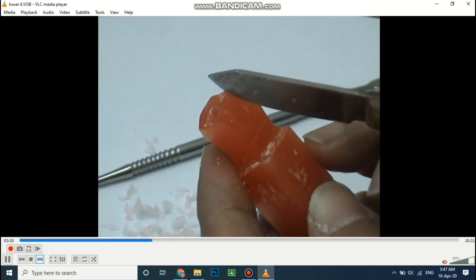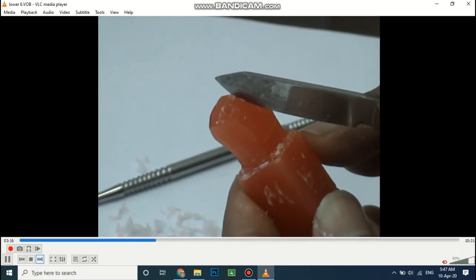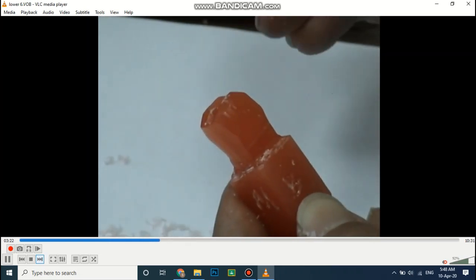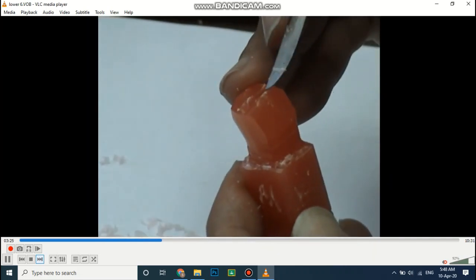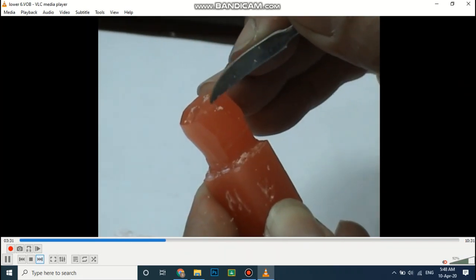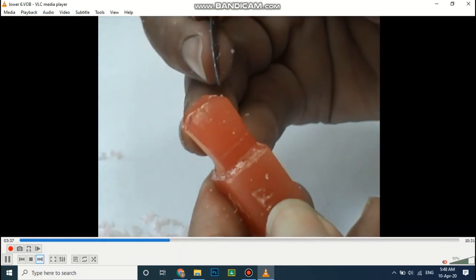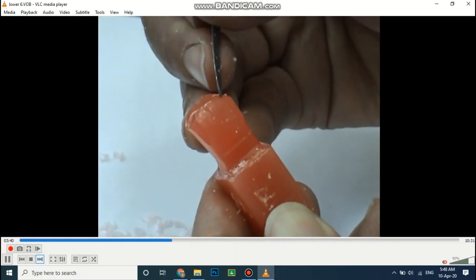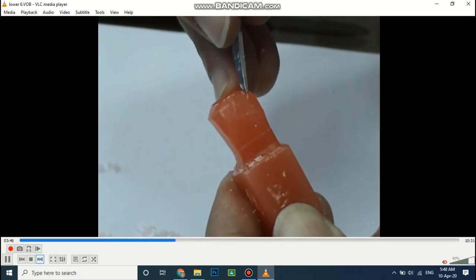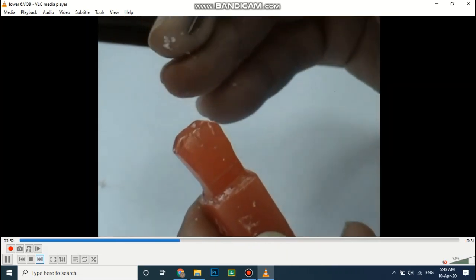Separation of the buccal cusps. From the mesial end to the mesiobuccal cusp, we draw a 2 mm line away from the midline by 1 mm mesially. As you see, away from the midline by 1 mm mesially. The remaining area, the distobuccal remaining area, is divided unequally into 2/3 and 1/3. Then draw a 2 mm line to separate the distobuccal from the distal surface.